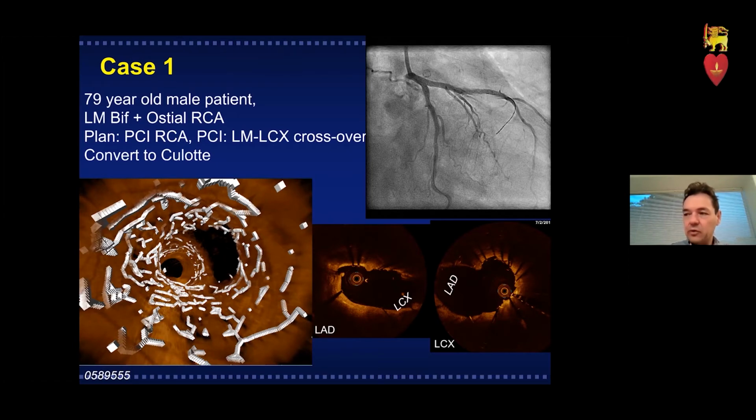That means that you have to have your guiding catheter nicely in the left main shaft. Now, if you want to stent out to the ostium of the left main, then your guide catheter has to be out in the aorta, and your flush won't clear the vessel enough to see the left main.